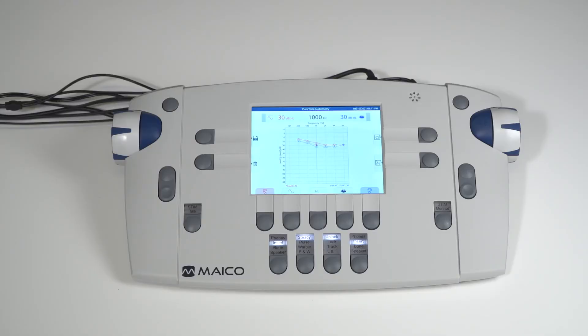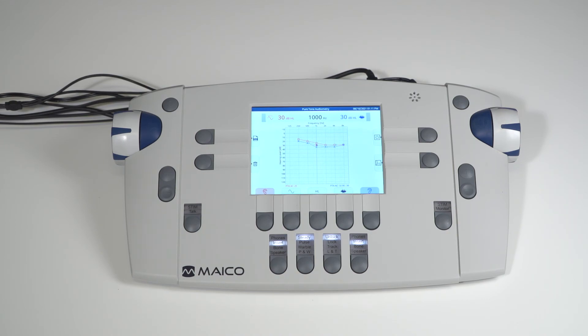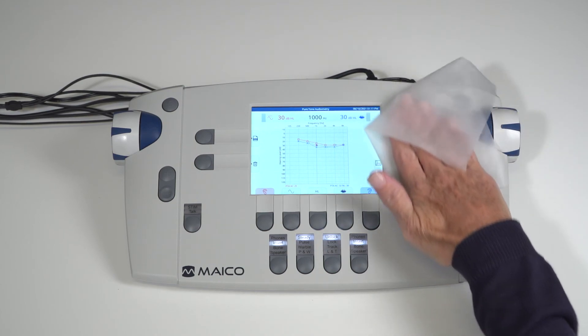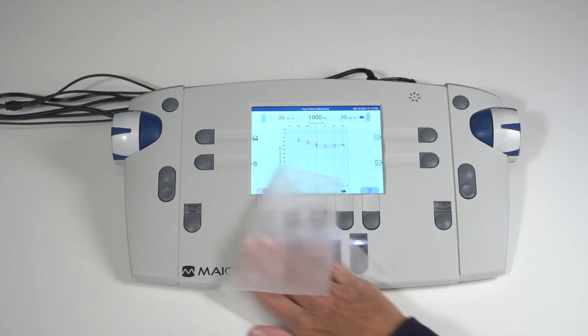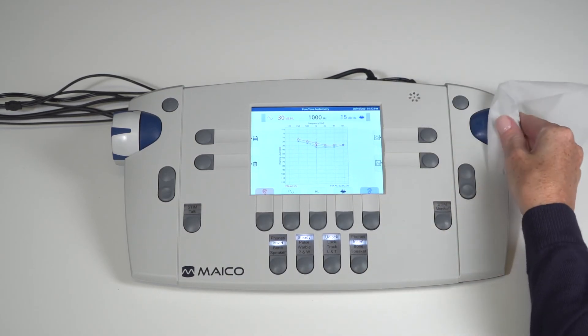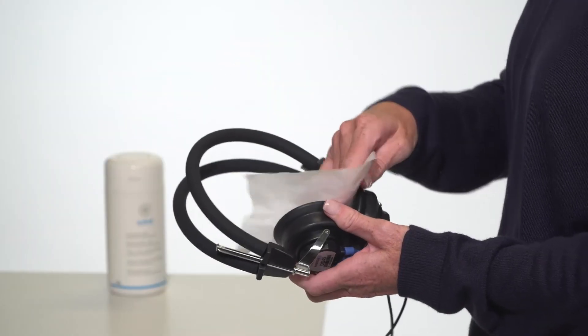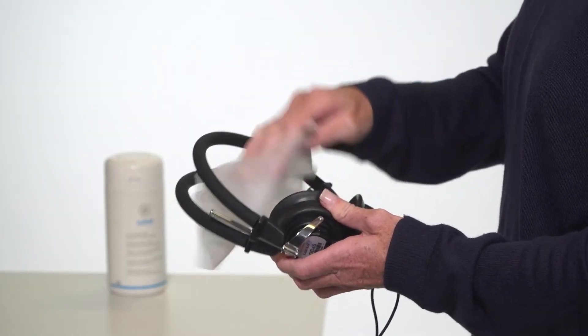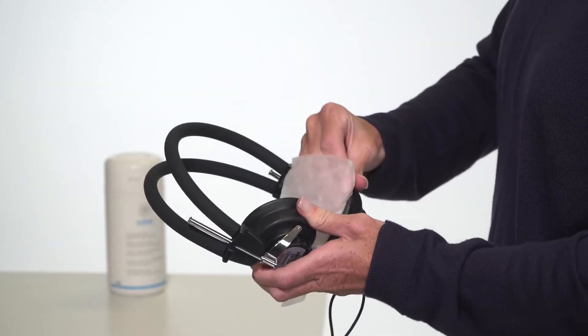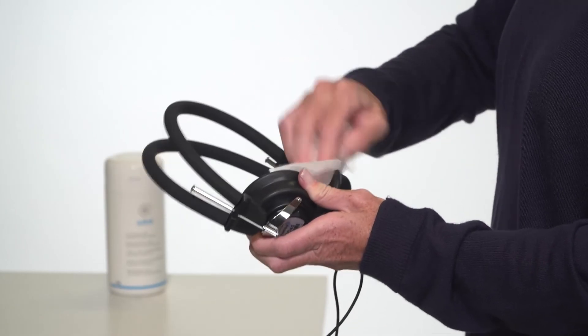The MA42 audiometer is a calibrated medical device and should be handled with care. The unit should be stored and used at room temperature and extreme heat or cold should be avoided. The audiometer may be cleaned with a damp cloth or a disinfectant wipe. Please follow your facility's policy and recommendations for cleaning and disinfecting. Avoid excessive moisture or liquid on the unit or headphones as this may damage the internal components.